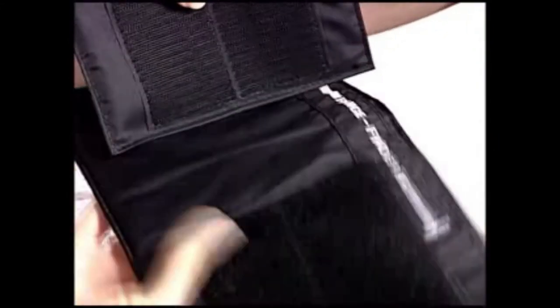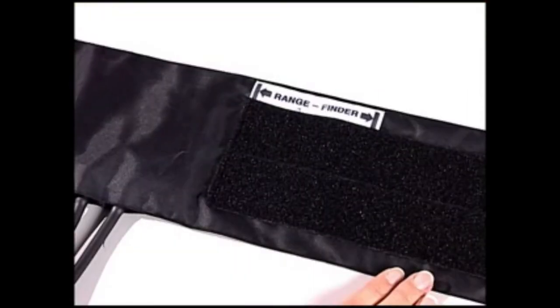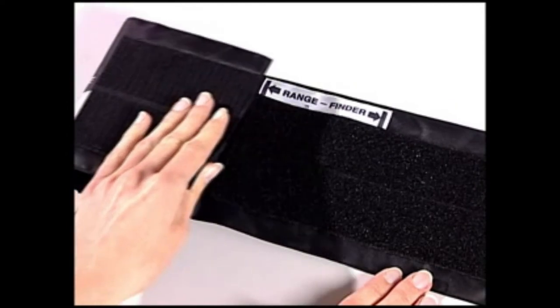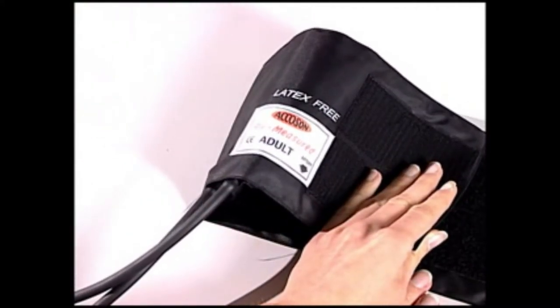Using the correct cuff size is an important factor in accurate blood pressure measurement. If the end of the cuff falls short of the rangefinder, the cuff is too large and a smaller one should be used. If the end of the cuff falls beyond the rangefinder, the cuff is too small and a larger cuff should be used.